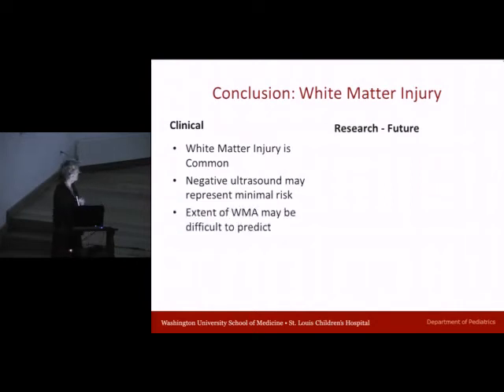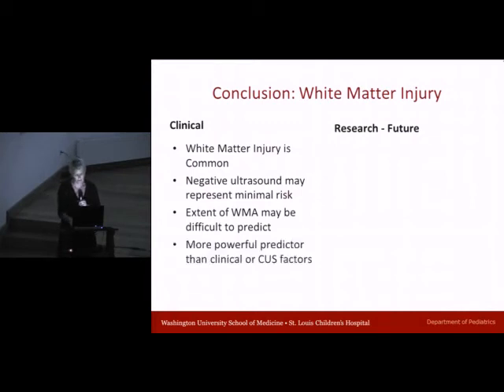The extent of white matter injury might be difficult to predict sometimes, and the reason being people are using a lot of different terminologies. And I would say that if you want to start classifying and looking at your white matter abnormalities on MR, which I would encourage you to think about doing, then find a scoring system that you're systematically happy with and apply that. Don't let people just start talking about loss of volume or some focal signal abnormalities, because any of those individual components are not going to be very predictive or helpful for you.